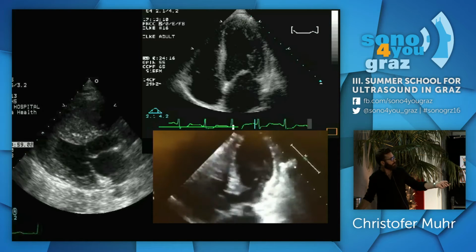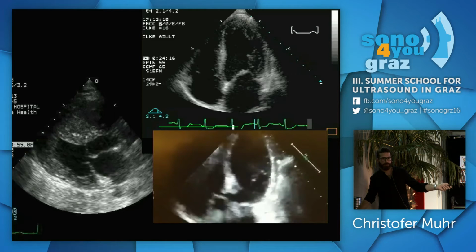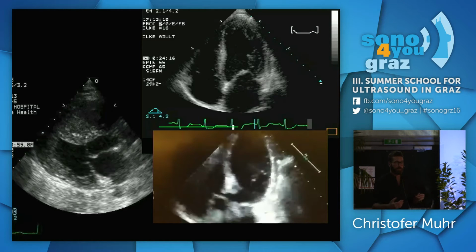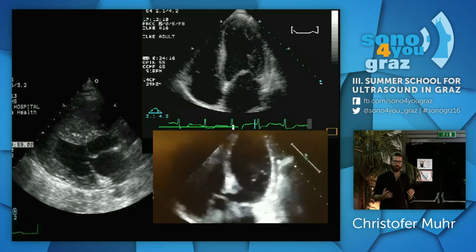And here is a lady whose dog died suddenly by a car crash. Did you see that it wasn't moving at all up here, but moving down here? That's what some people call the broken heart syndrome, or takotsubo, or apical ballooning, stuff like that. Caused by severe stress, usually psychological stress, sometimes physical stress. It has a good prognosis, but you can actually go into a cardiogenic shock just by that.